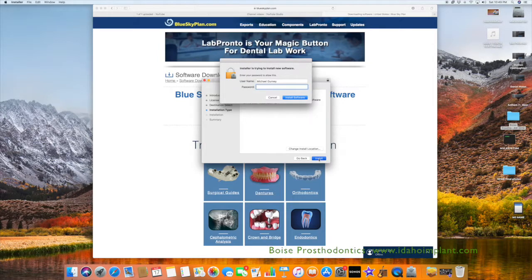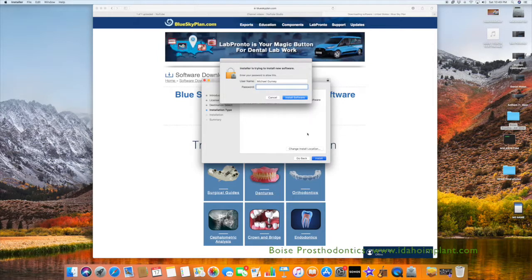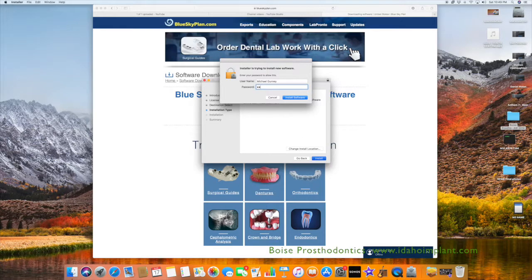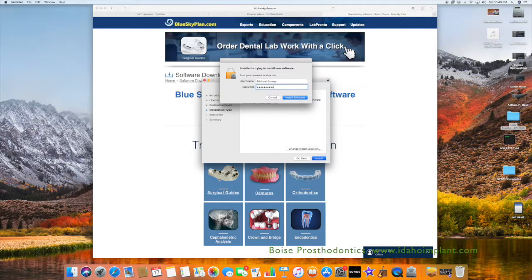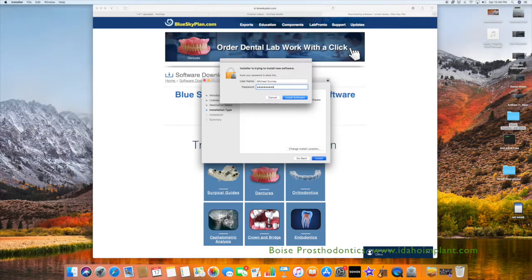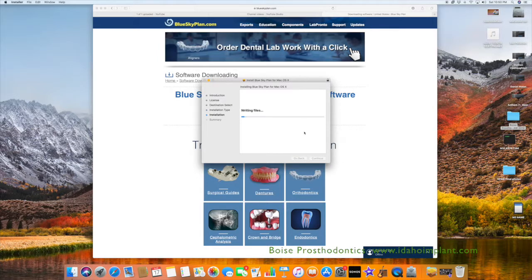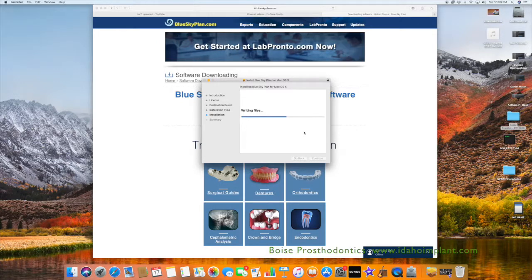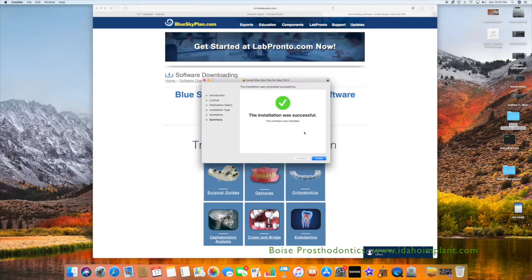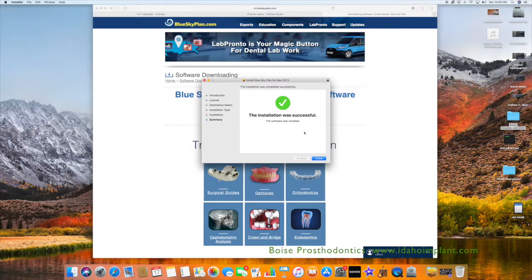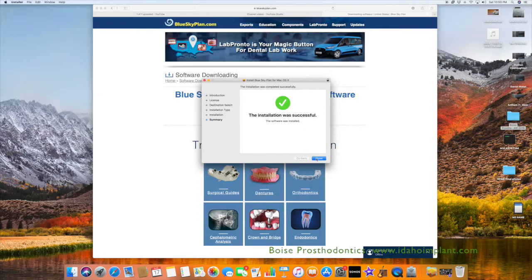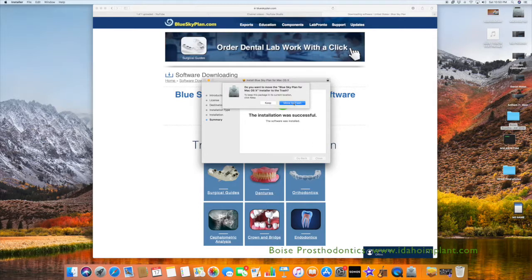You'll have Mac always ask you to provide your password for your computer to make sure that you want to download this file to your computer. Once you've entered it, the installation process will start and it will ask you to then register the software.